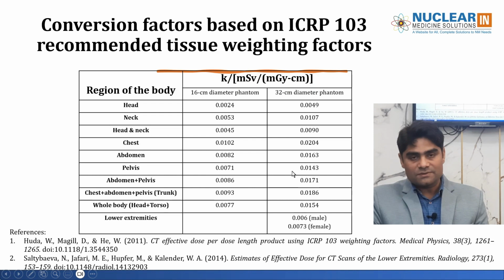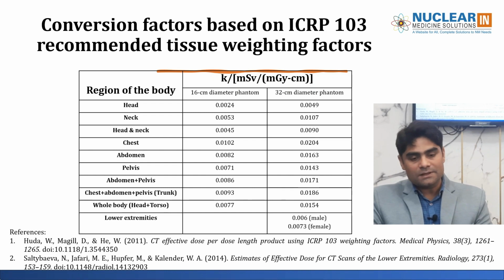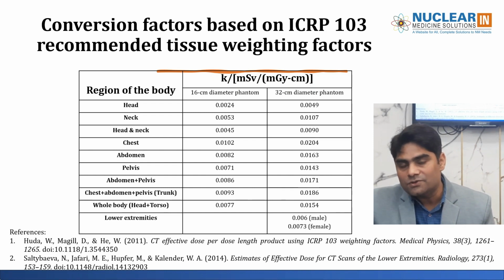These are all values which can be useful for us while doing PET CT, because as we are doing whole body scans, these conversion factors can be used while we are doing the CT dosimetry in PET CT.